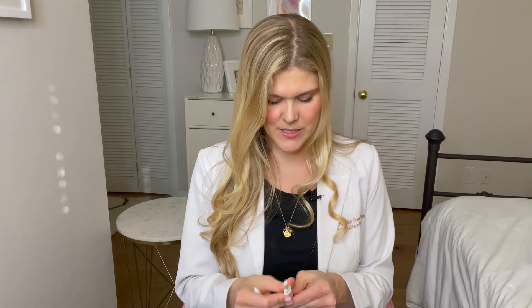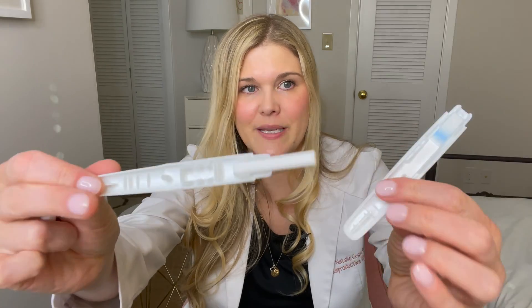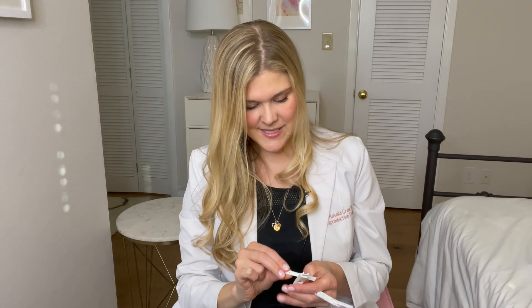The dip-in urine tests are smaller strips — it actually looks like the inside of this test if I crack it open. Here is our little tiny paper strip with an absorbent tab — essentially it has dye on it. The dye moves across and you need to see a secondary line if your LH is surging. So if you're doing the dip test, you pee into a little cup and dip the strip in, then wait. It's the exact same test, testing for LH.